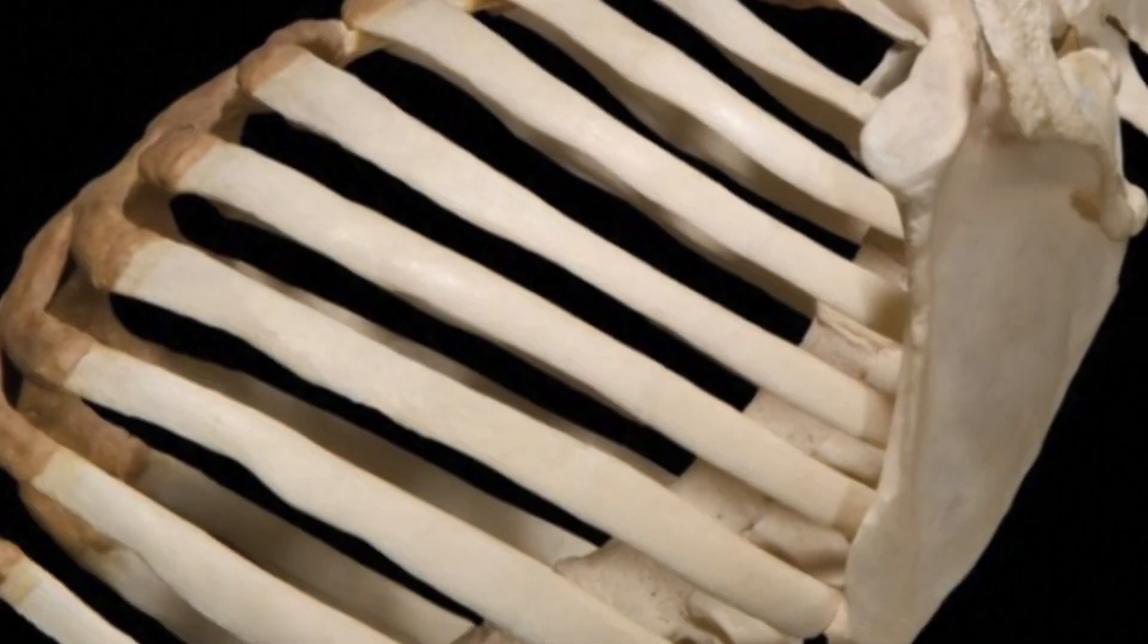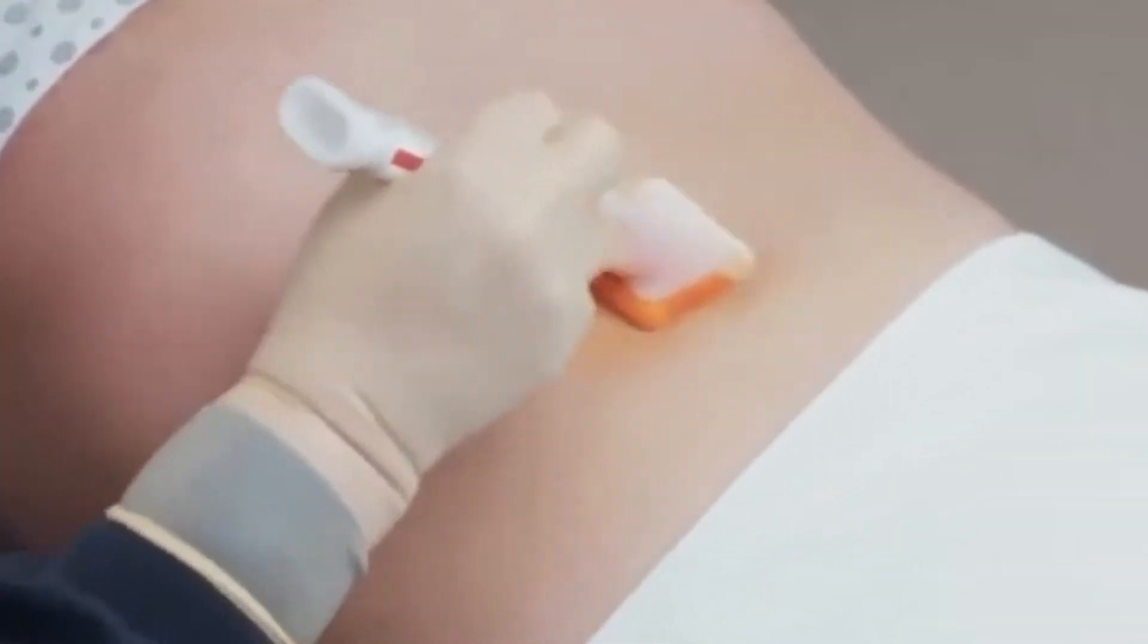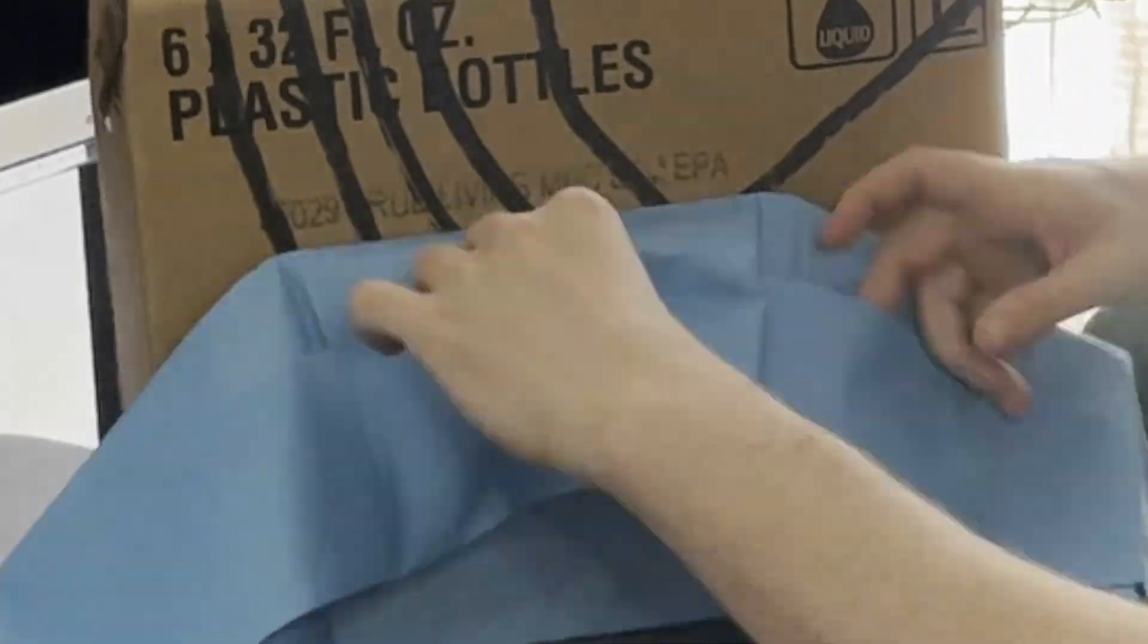Okay, so this model demonstrates the intercostal spaces as well as our target area, which is in the triangle of safety. We have already chloroprepped the patient, which comes in the kit. We've draped it, we've put on our sterile gloves, and we're ready to start the procedure.